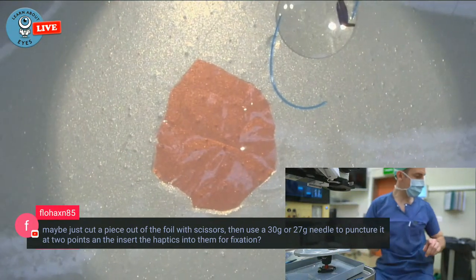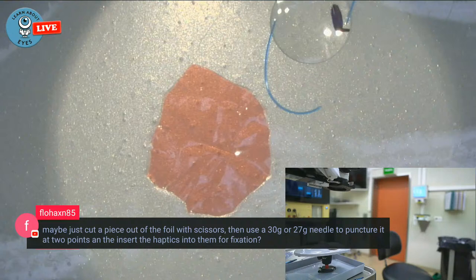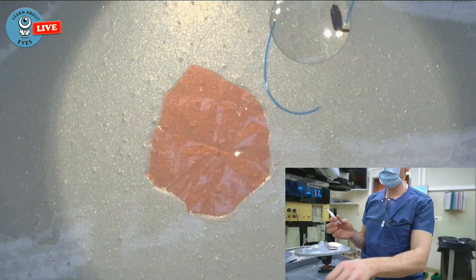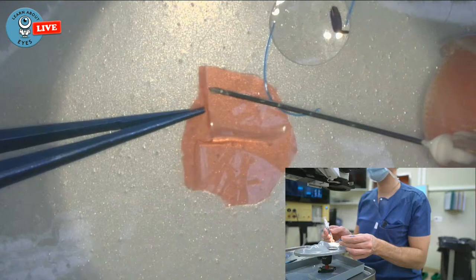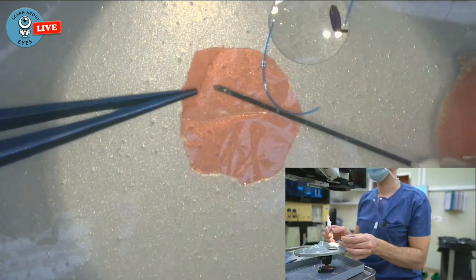Let me just get a 27. I think I have a 27 gauge somewhere. What's on there? It's sticky. All right. Don't want to make the hole too big. Okay, that should be fine.